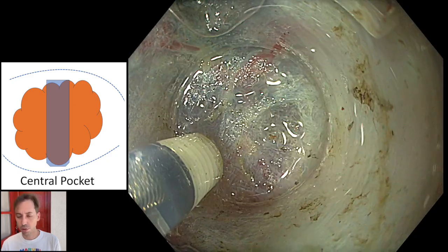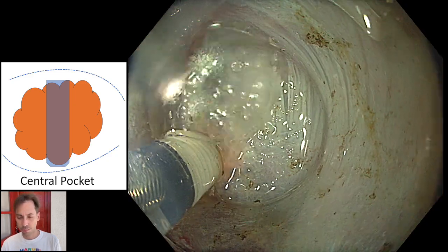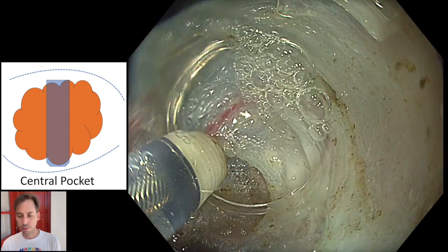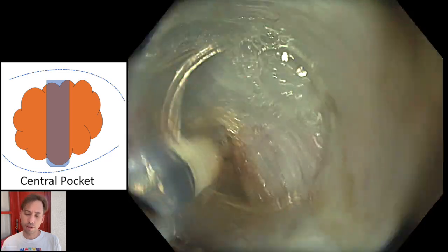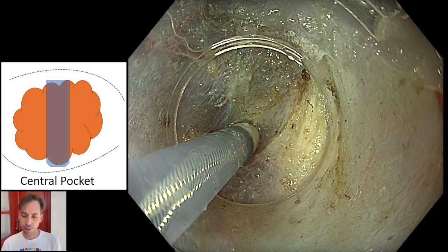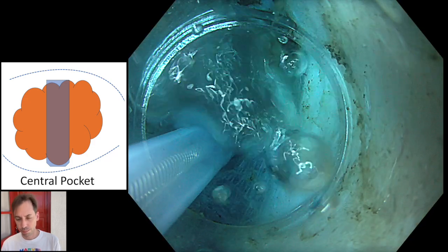So we try to work close to the muscle. And the purpose is to reach the other end of the tunnel in the area of the oral incision.